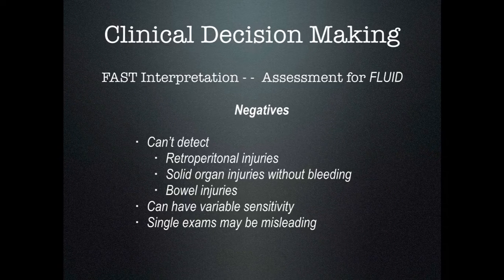And single exams may be misleading. So you may exam initially have a sensitivity of 31% and miss the diagnosis. So you should always avoid doing a single FAST exam. You should either do serial FAST exams or a FAST exam and a CT scan.